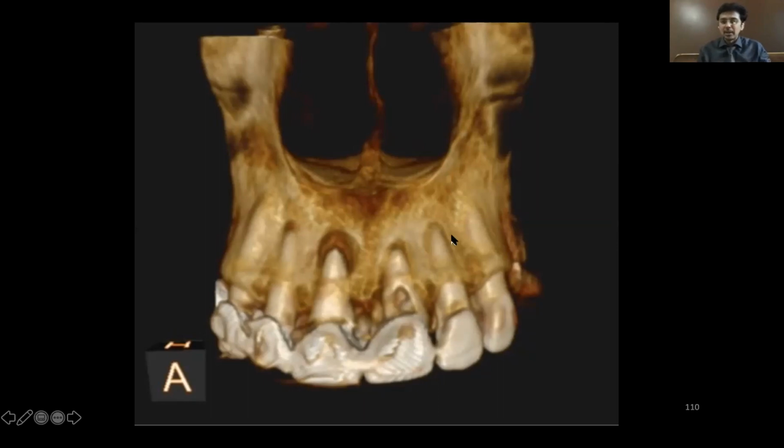But in order to excavate this periapical pathology, we need a very special instrument. What's the name of that instrument? Which was the instrument which we had taken up? Do you remember? Lucas, excellent, Dr. Gajanan. Lucas bone scoop, excellent. So now the full form name has also come. Okay, so Lucas bone scoop.